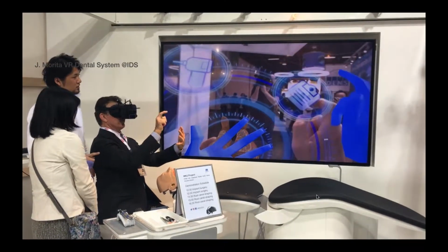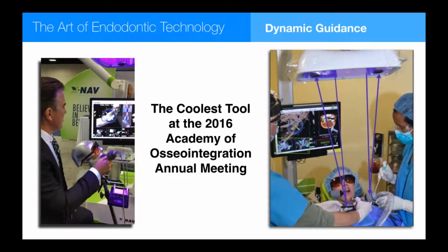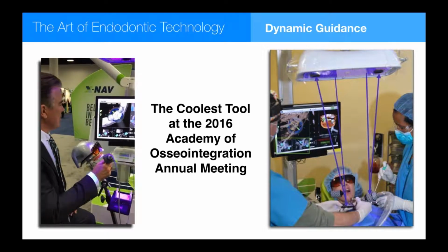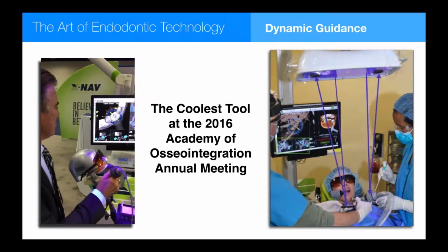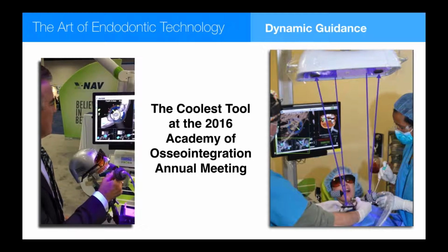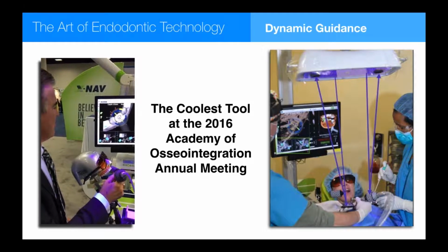And this is an optically guided system. Shortly before this, however, at the Osseointegration Academy meeting in San Diego in 2016, I'm walking the exhibit floor. I walk around the corner, and all of a sudden, this challenge I've had with how are we ever going to use static drill guides in conventional endo is answered with a dynamic guidance system.